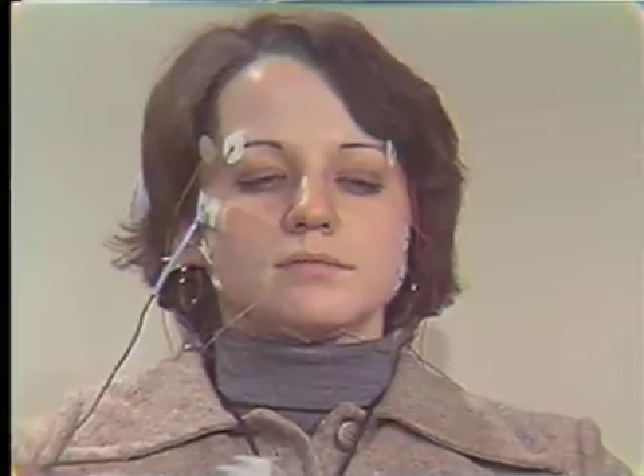At this stage we will return and have a superposition of Karen doing an open, close, and clench again. You can take the gum out if you like, Karen. Alright Karen, do it five times for me. Now notice that was fairly irregular — a patient with no pain at all will superimpose one on top of the other. This time Karen, do it a bit harder, faster, and more definite, and see if we can get more regularity. Now that was a better trace. And so you can see that you can educate the patient to control their opening and closing. And if you remember the slide I showed you previously, Karen could not do that — she deviated to one side.